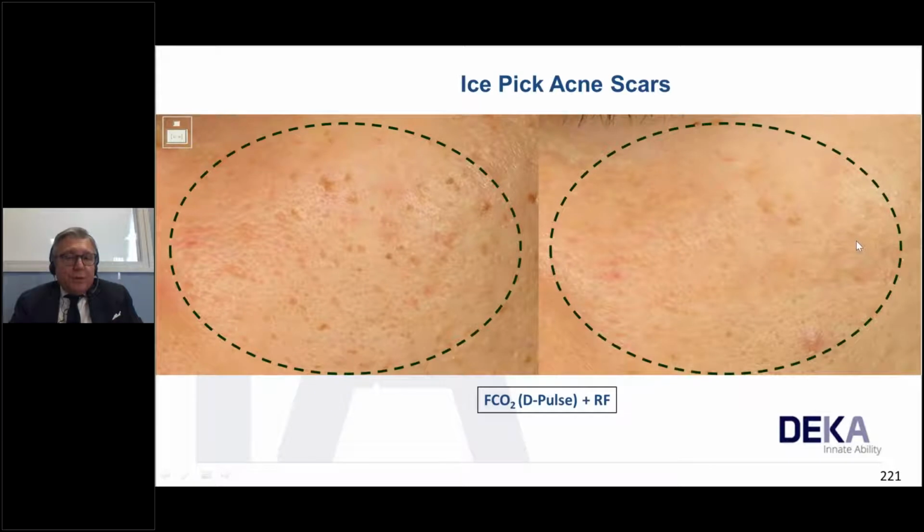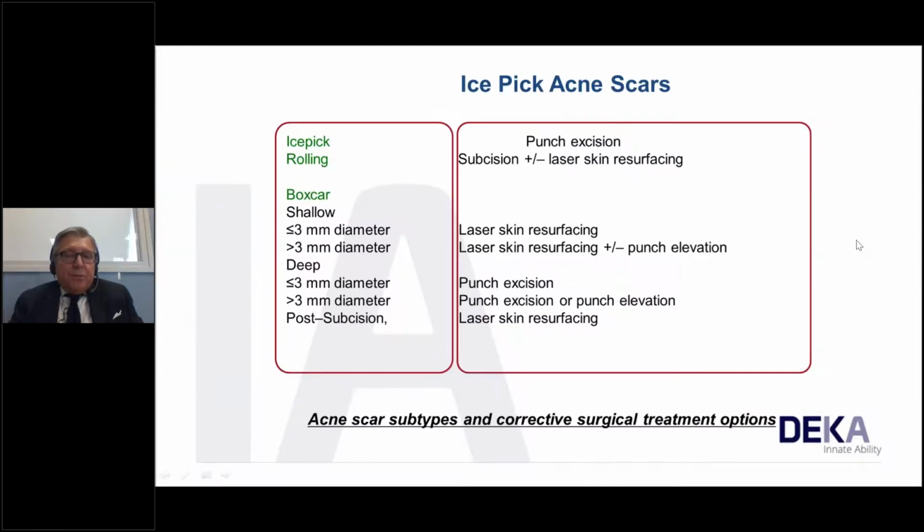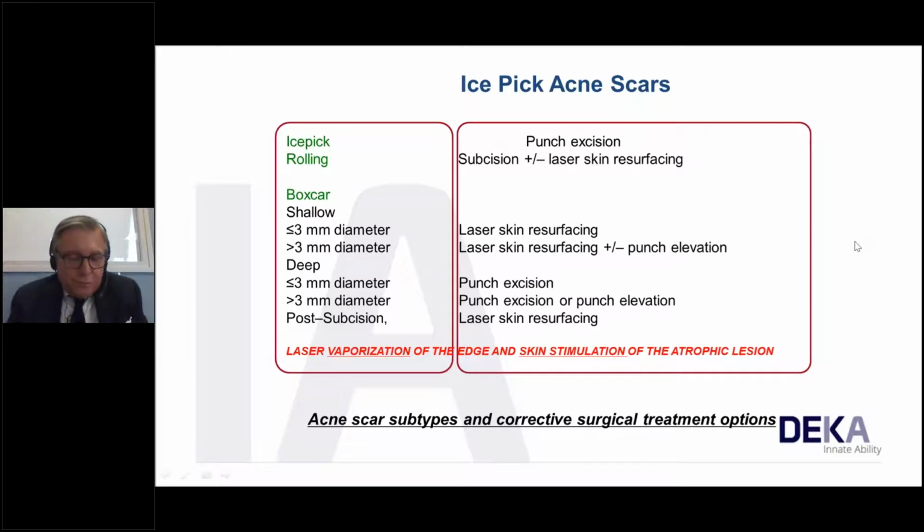I think it's very important. In terms of tips and tricks, I recommend to you the use of the freehand and scanner in the same session, because we can have in our armamentarium a lot of strategies that you can see in this slide, but we prefer in our protocols to use the laser.